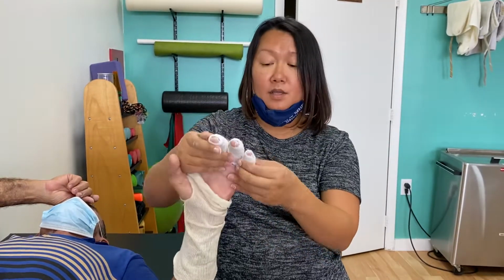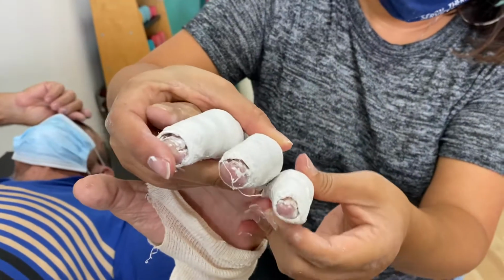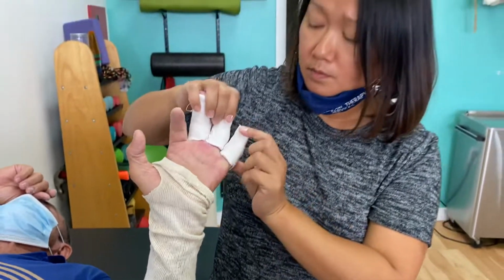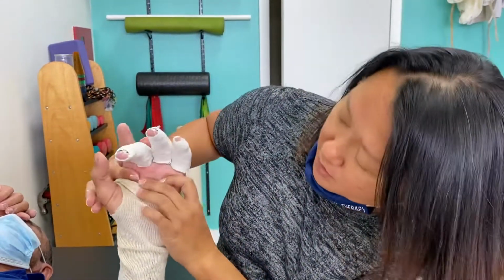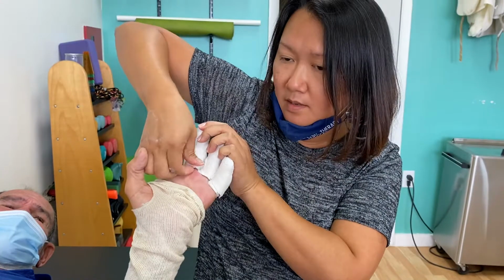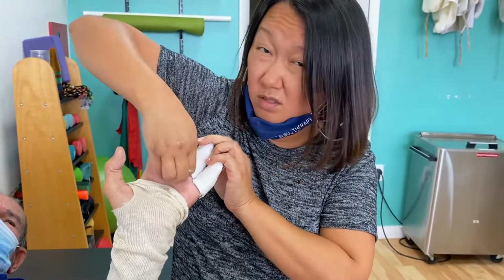When it comes to casting, especially if you're casting multiple fingers, or even if it's just one, you want to check in between the fingers. You want to make sure that these things are not pinching the skin, right? So I tried to alleviate some of that. You're also wanting him to bend. So you want to make sure that if you're pushing in, it's not cutting into his palm. So I've had to pull back and break some of that cast out. Right? Soften that part. I went a little too deep.